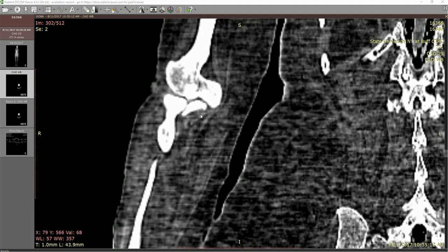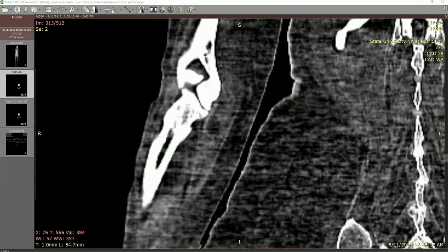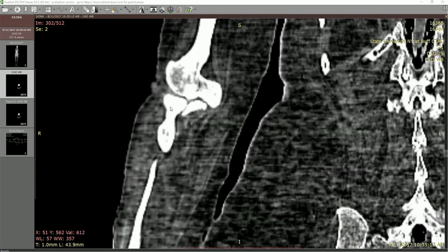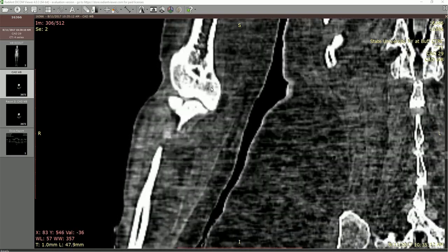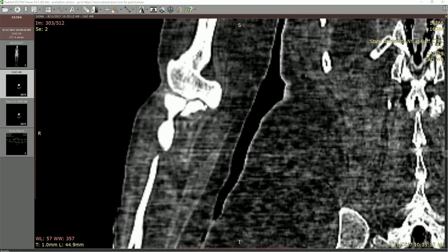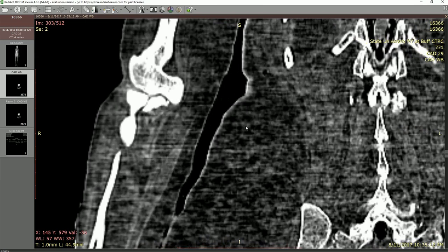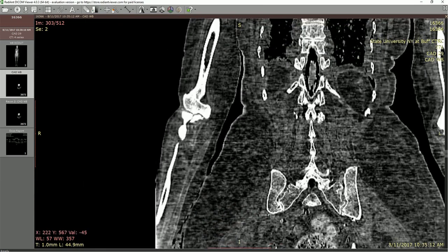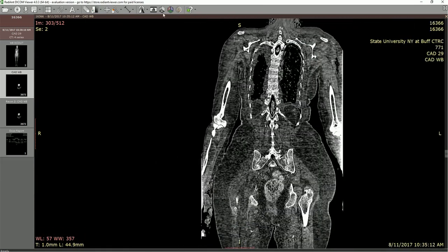Quick view of the elbow here: this would be the ulna out on this side, here's your radius, and there's your trochlea and capitulum of the humerus. I think that probably does it for the coronal view.